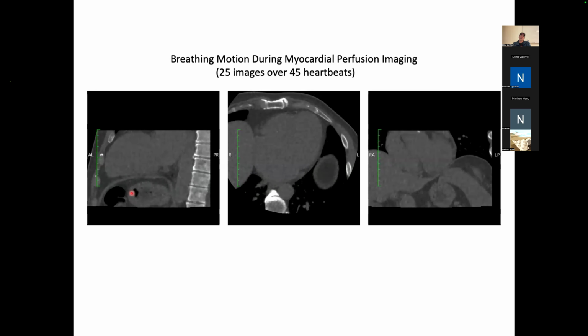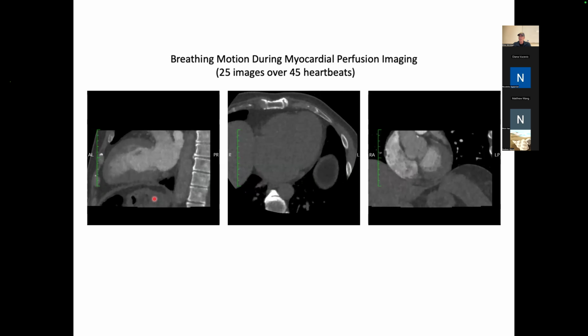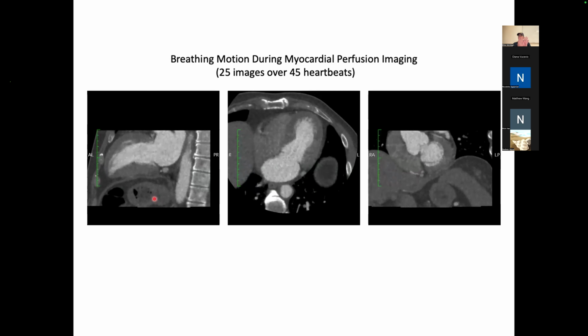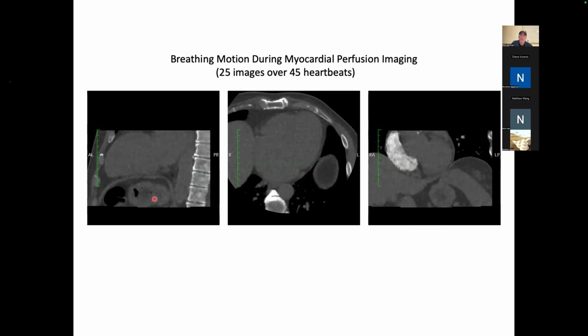Those of you who are looking at this would just say, well, I can see this is a coherent picture of the same object every time. So I can just map one heart onto the next time frame. Just pick a time frame and map everybody back onto that time frame. And that can be done. And it's done pretty successfully.